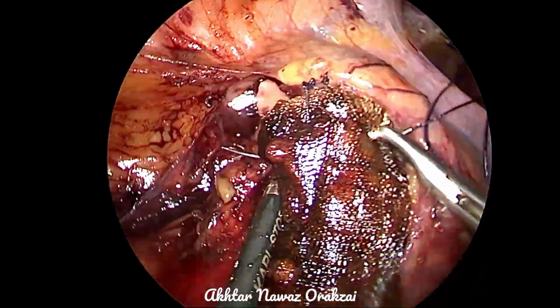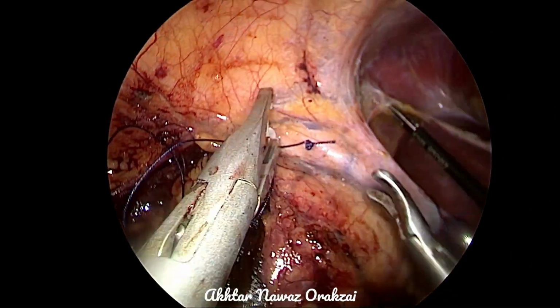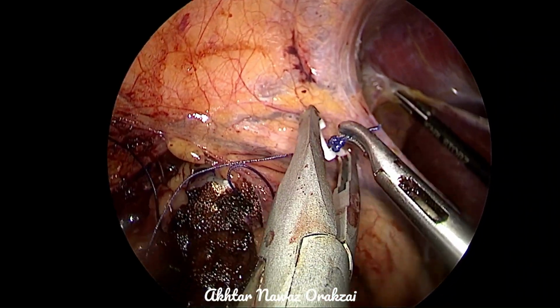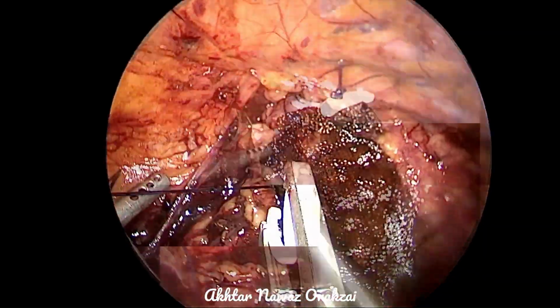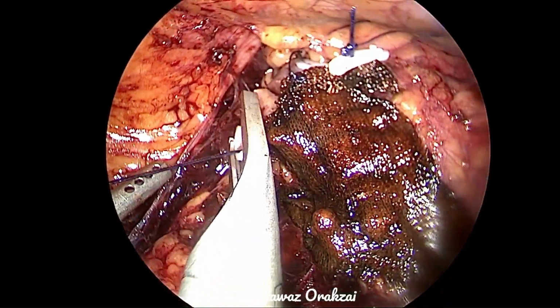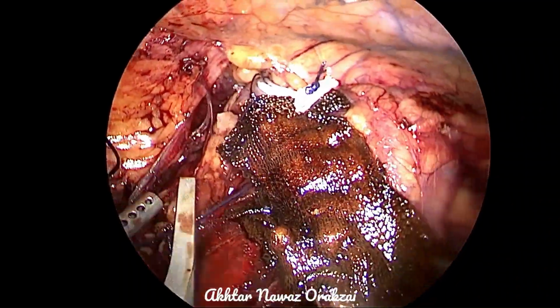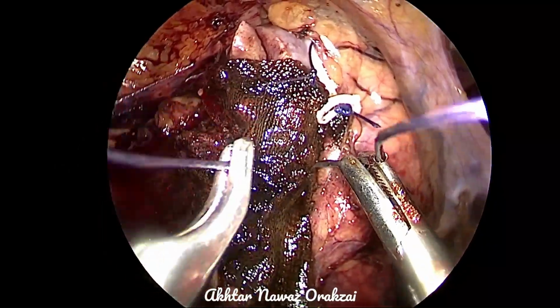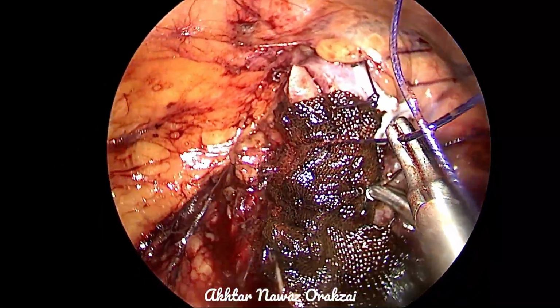Another layer of Vicryl 1, which is a little deeper than this Vicryl 2-0, will provide a little more hemostasis. It will also cover the rent in the lower pole calyx.